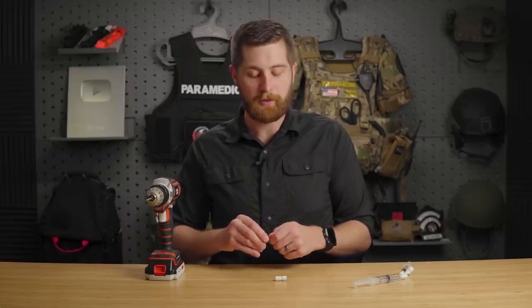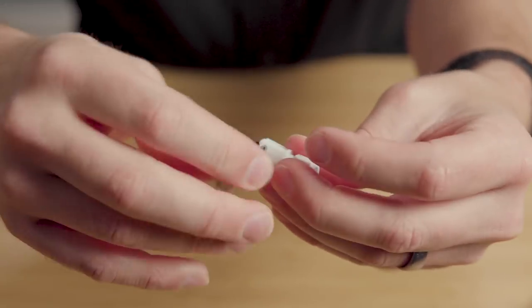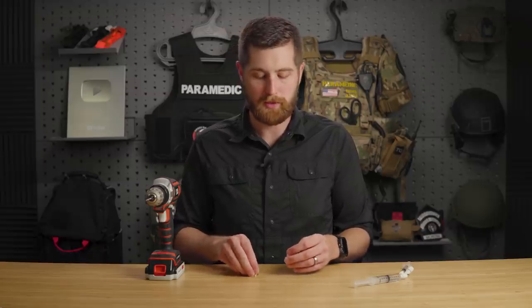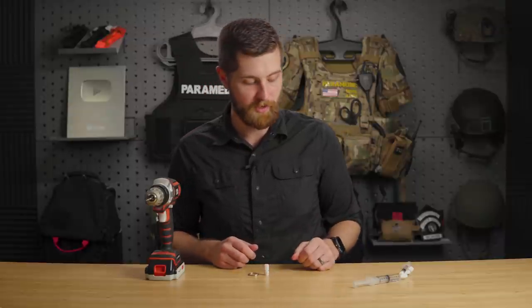Finally, the last step is taking the key ring and threading it through the cap and letting it hang. Now this is technically a one-time use. Once again, you have to fall back on your facility's cross-contamination rules and infection prevention.